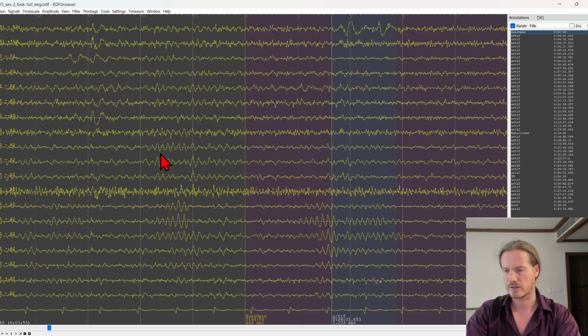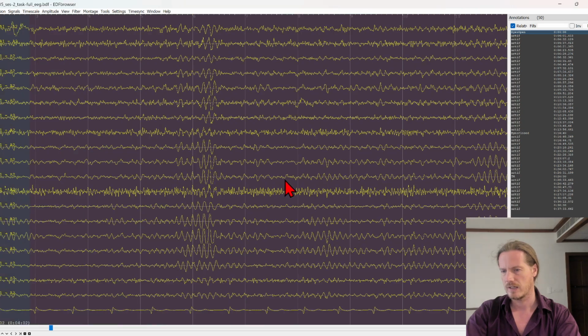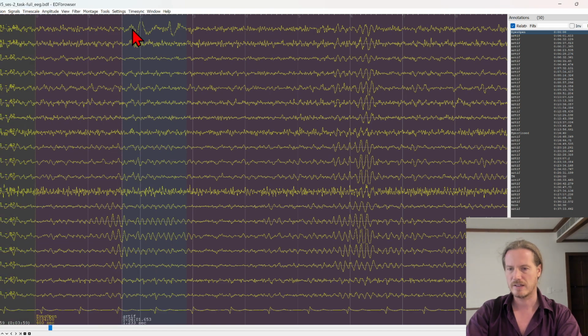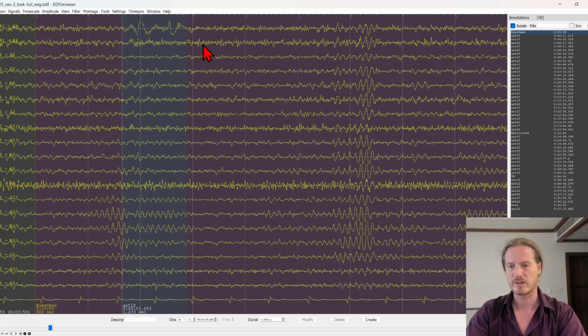And here it starts to get good. And we can see like one of the channels is a little noisy. Other than that, everything is fine. We can see their heart rate here as well. Their heart rate variability can be derived from this signal. And we can see a nice little alpha burst over here. And here there's something happening on top, and so this little section here I've selected manually and marked it, and that's why it has this color, and that gets left out of the EEG data.